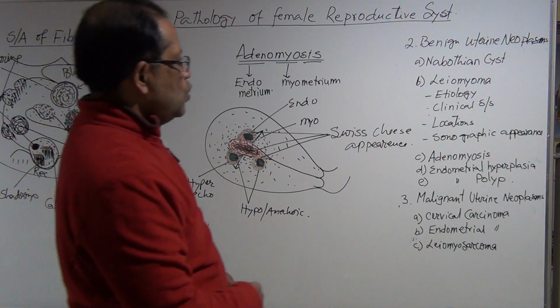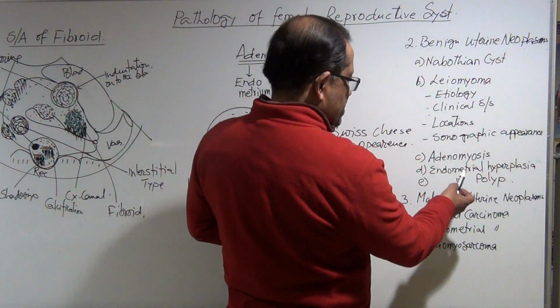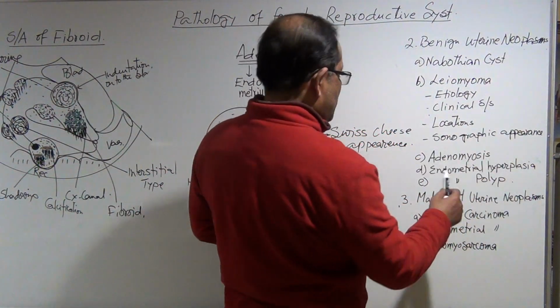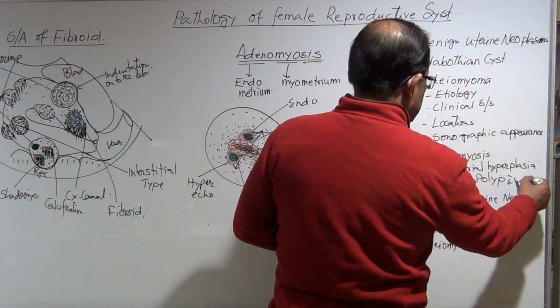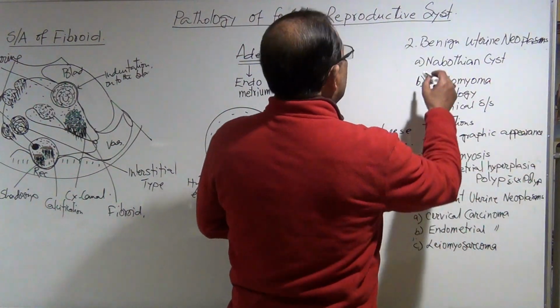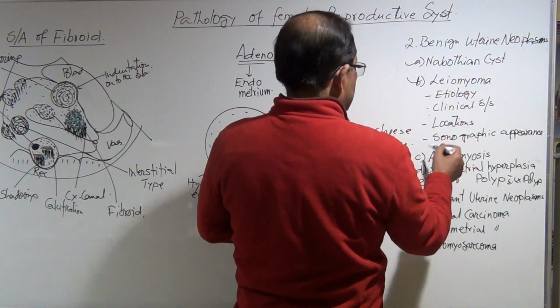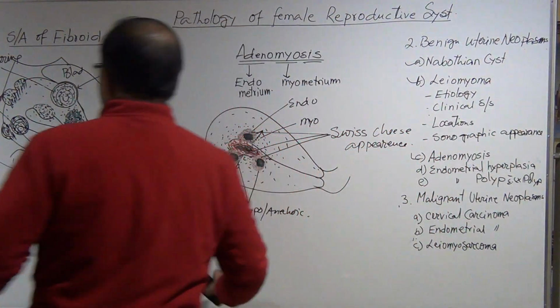Now I will go over endometrial hyperplasia, then endometrial polyp and cervical polyp. Endometrial hyperplasia. Okay.